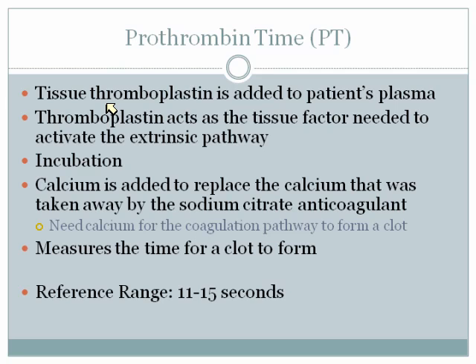We're going to incubate it. It incubates inside the analyzer. It's not like you have to take it out. There's a little incubation area inside the analyzer. Then we're going to add calcium. Calcium is an important part to add because remember, you have to have calcium in order for the clotting process to occur. Because you're drawing these in a sodium citrate tube, the light blue sodium citrate tube that we must use for coag tests, that sodium citrate binds calcium and takes it out of there. So we need to add the calcium back in when we're testing so that we can get that clot to occur.